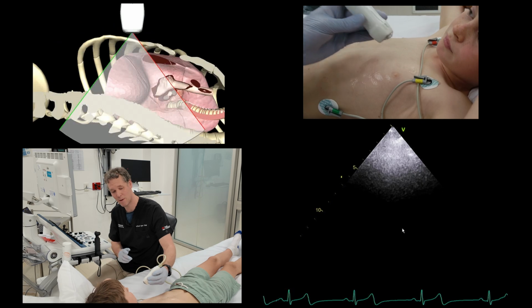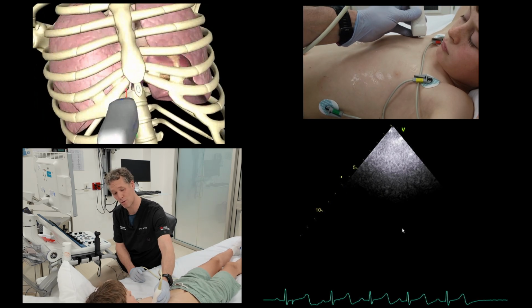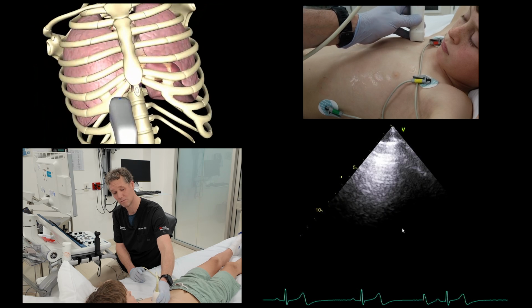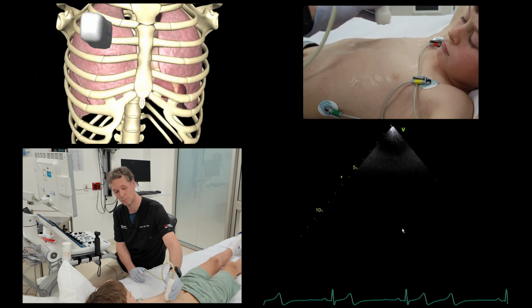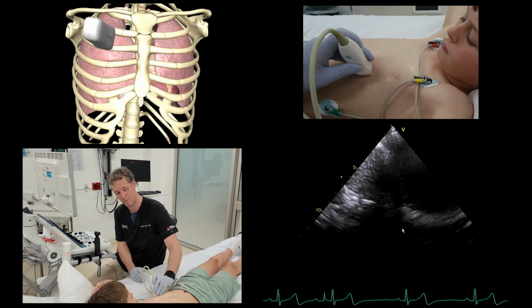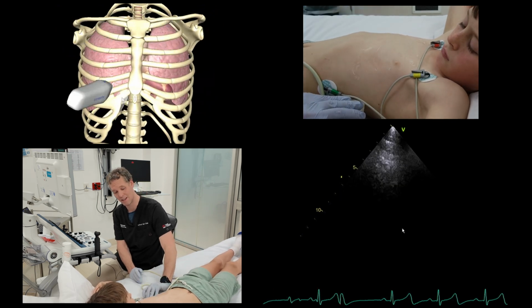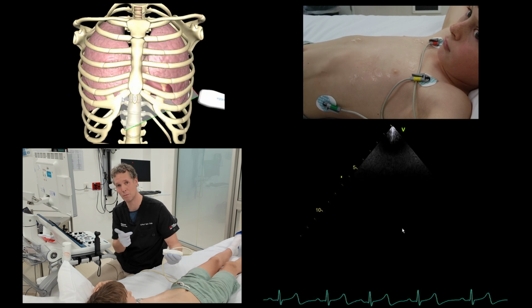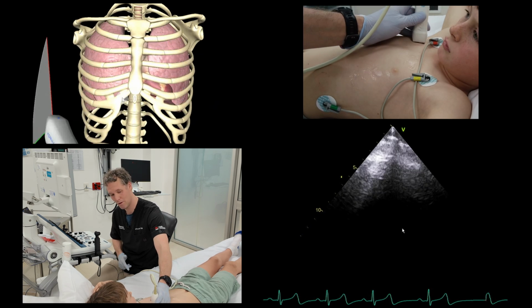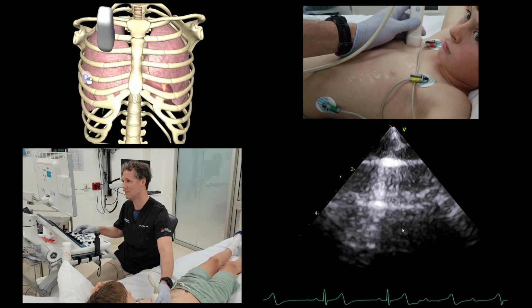I hold the probe in the same way, but I have the marker pointing towards the patient's head. And I'm going to put the probe where I listen with a stethoscope. At the top of the right lung, top of the left lung, bottom of the right lung, bottom of the left lung, posteriorly of the right lung, posteriorly at the left lung. And I'm looking at 2 things, pleura and parenchyma. So for pleura, I reduce my depth to about 5 centimeters.